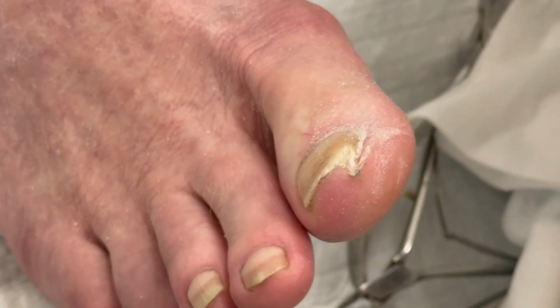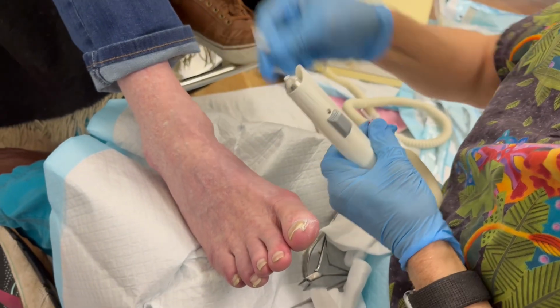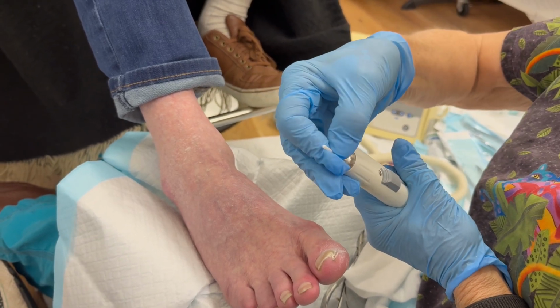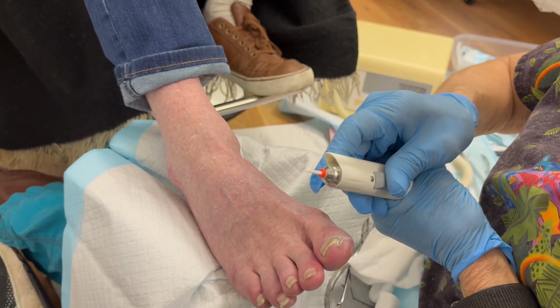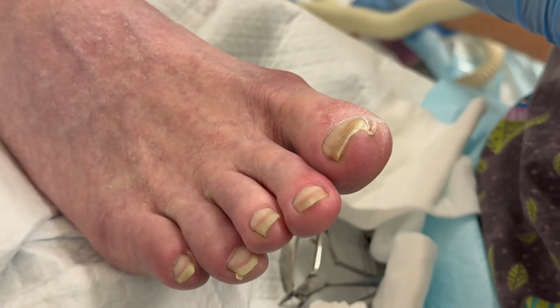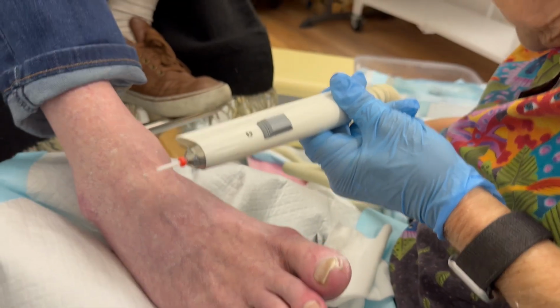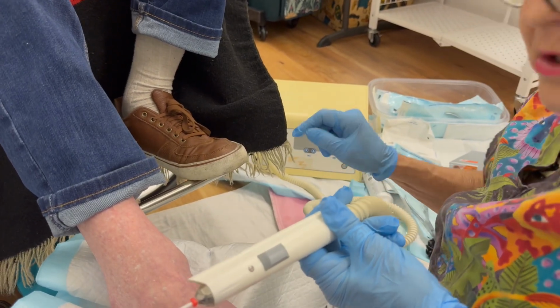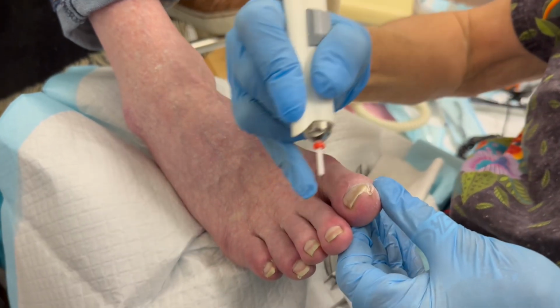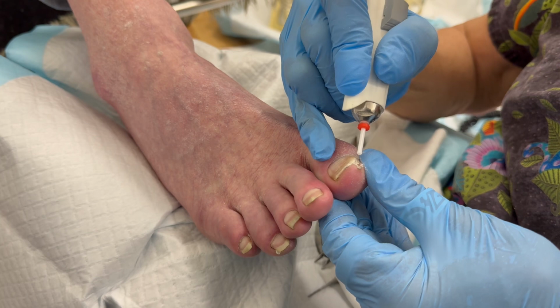So I'm going to stop and put in this handy dandy little guy, which is, I don't know what you would call it, just a long thin piece. And these are ceramic burrs. Okay, we've got that. Here we go. I'm also going to put this in reverse. No, that's the wrong thing. Reverse. There. Okay, now it's turning around, going the other direction, because I'm going up and away from me. And that way I have more control and I can see better, if that makes sense.